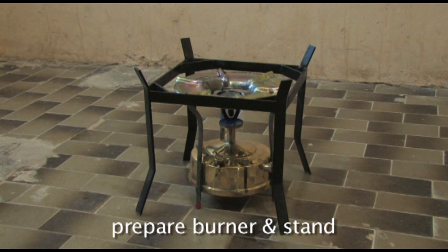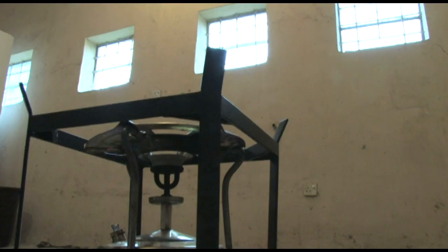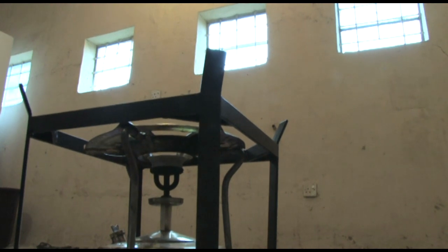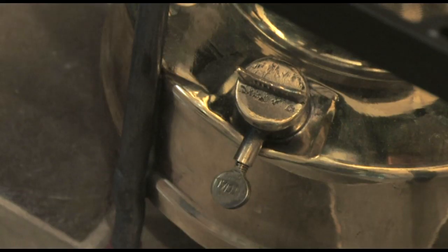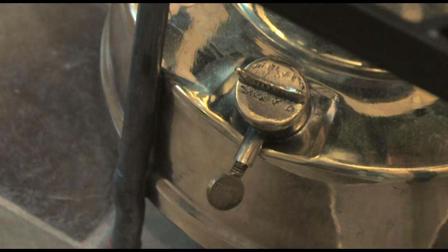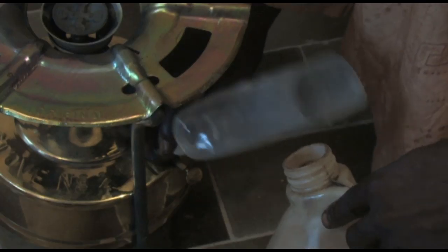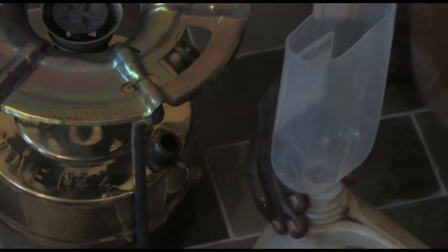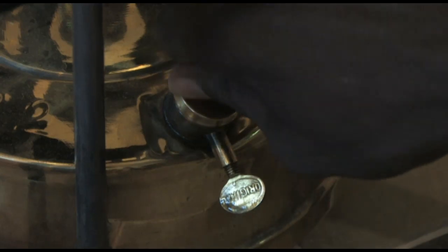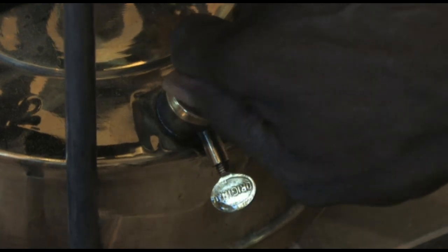Next, place the stand and burner on a stable surface that is safe for firing the burner. Make sure that there is sufficient ventilation, but remember that the burner needs to be sheltered from the wind or fit a windshield. The air screw must be loose so that air can escape as kerosene is poured in. Unscrew the filler cap and make sure there is sufficient paraffin or kerosene in the tank — approximately three quarters full — then replace the cap.